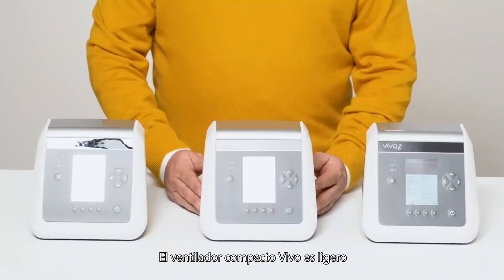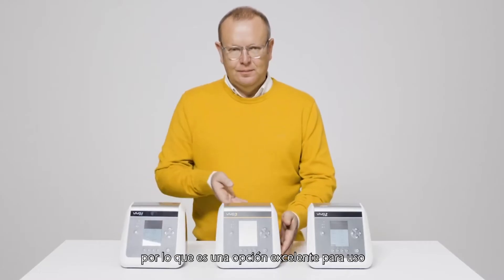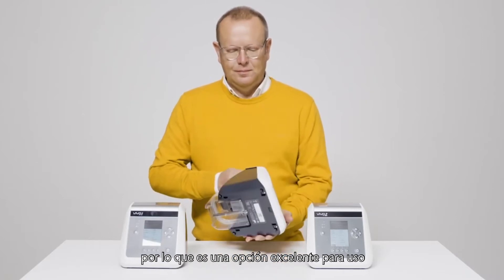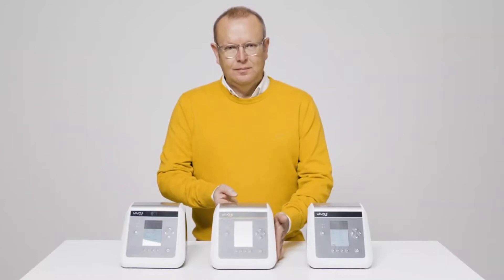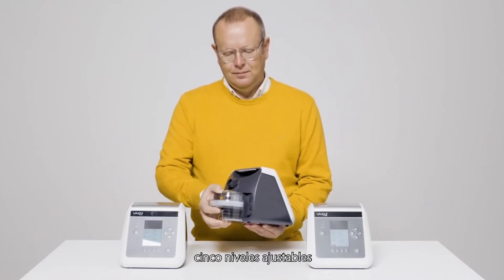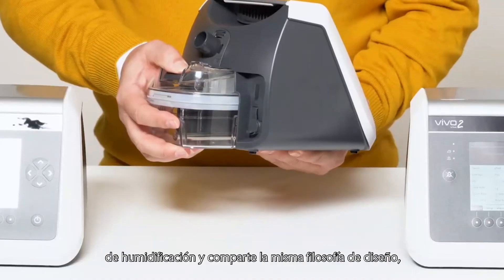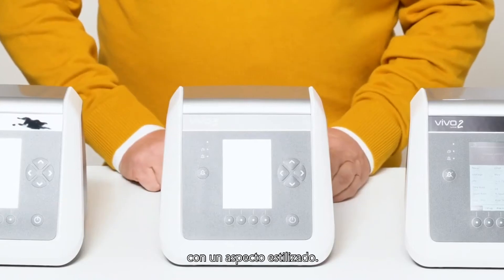The compact Vivo ventilator is lightweight and has a truly small footprint, making it an excellent choice for home, mobile and hospital use. The integrated humidifier, allowing for five adjustable levels of humidification, shares the same design philosophy, giving it a slim appearance.